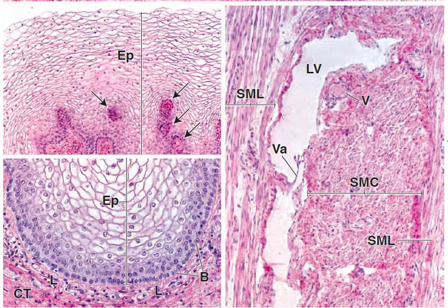Okay, so on the right-hand side, we've got the muscularis of the vagina. This higher magnification micrograph of the smooth muscle of the vaginal wall emphasizes the irregularity of the arrangement of the muscle bundles. At the right edge of the figure is the bundle of smooth muscle cut in longitudinal section, and adjacent is the circular section.